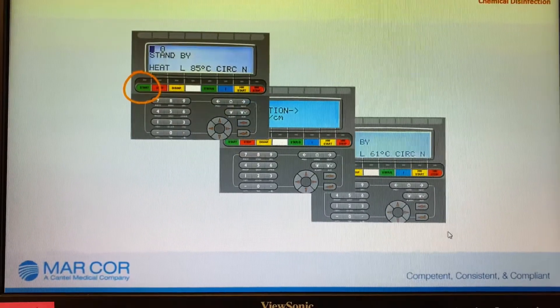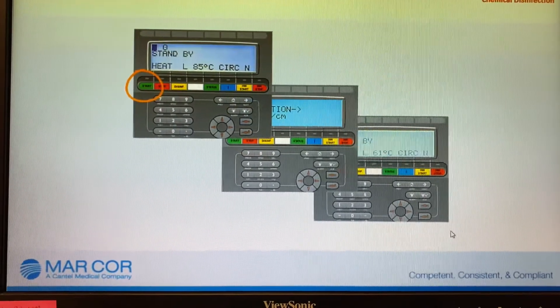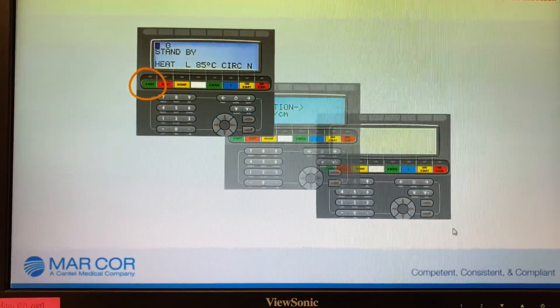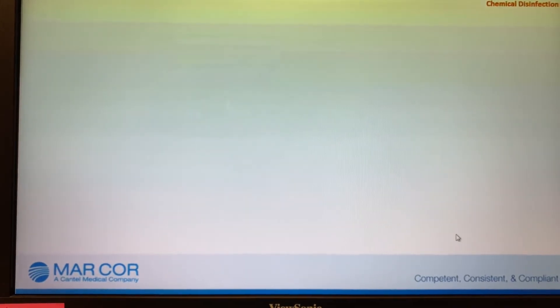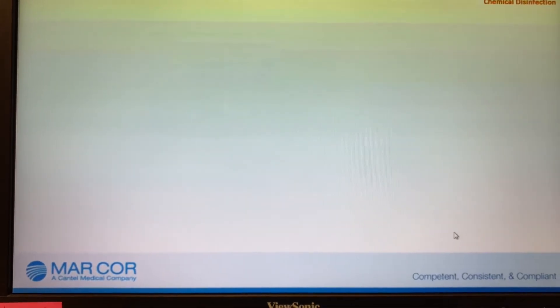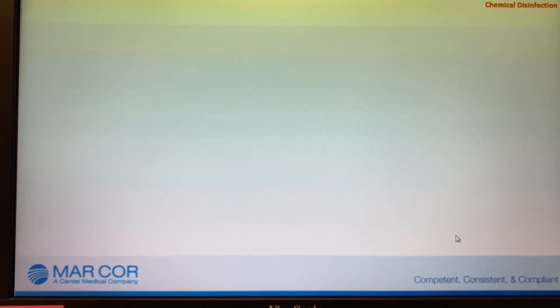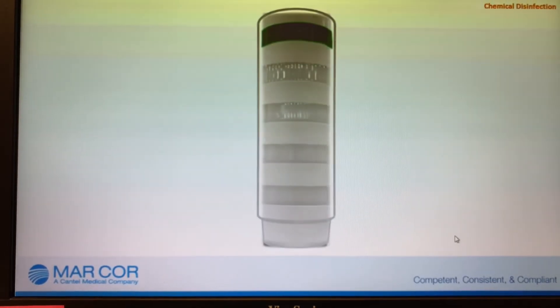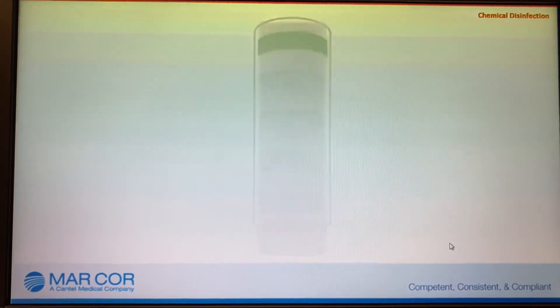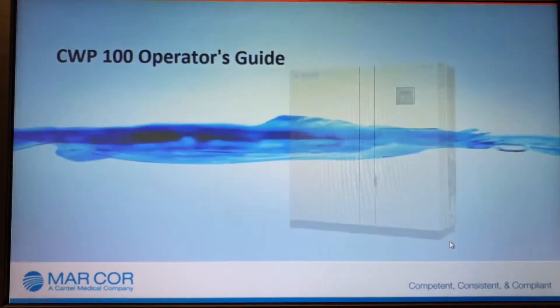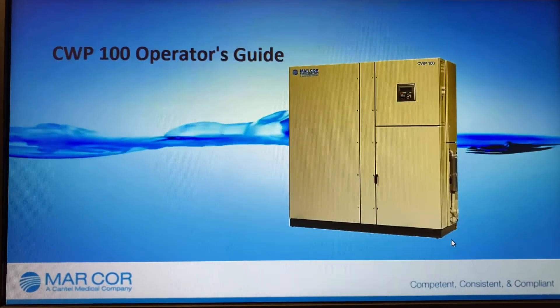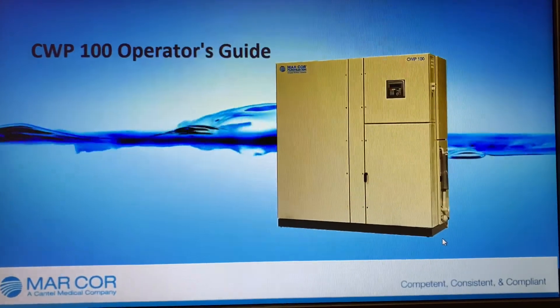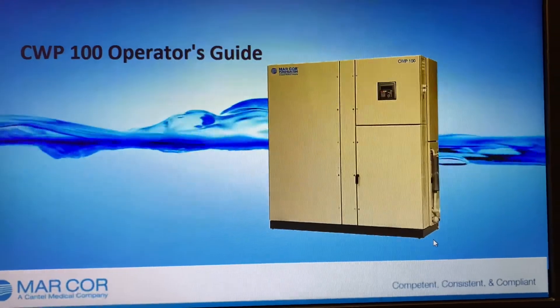Press start. Dialysis machines can be started when the display goes to operation and the lamp indication unit displays a green steady light. This concludes the CWP 100 Operator's Guide.